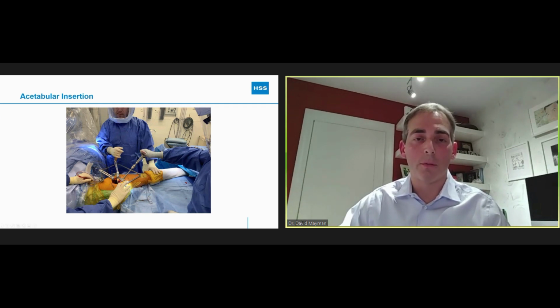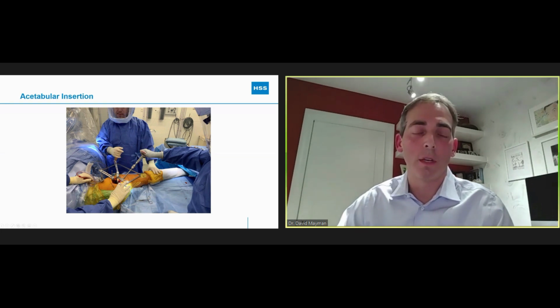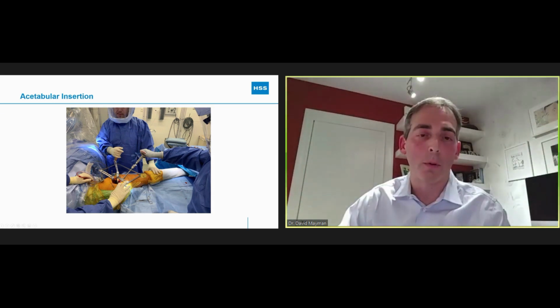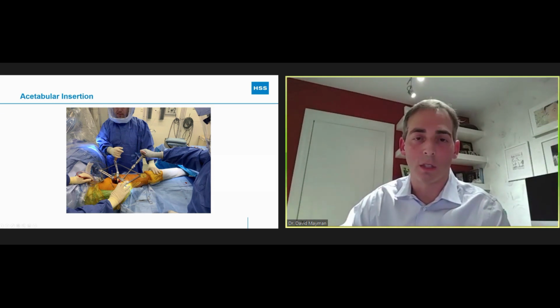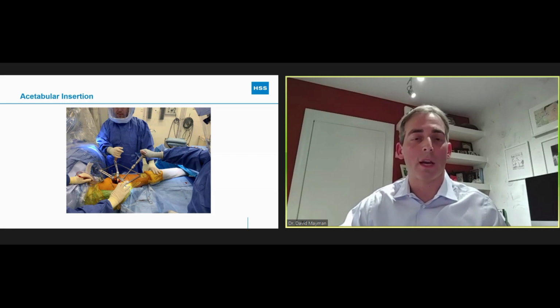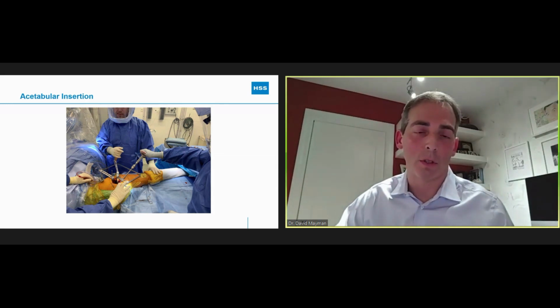So there's an acetabular insertion handle here. There are threads for every brand of acetabulum. So this is implant agnostic. You can use whatever implant you want. And I start by putting my implant partway in, so just a couple of taps, just so it gets a little snug in the acetabulum. And at this point, I'm looking at my bony landmarks, transverse acetabular ligament, putting that acetabular component where I think that acetabular component needs to go.